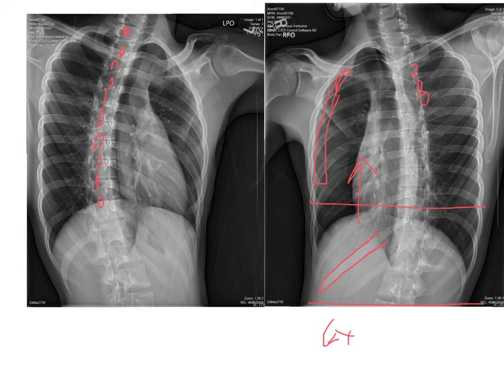Also remember that on below diaphragm projections, you will always do those AP. If you can do them supine, that's even better, because that flattens the abdominal tissues and organs so that you can penetrate more through those organs and tissue to get better detail of ribs 8 through 12. You will also do oblique below diaphragm ribs. Since you're starting with the AP position, you will only do an LPO or an RPO projection for the ribs. Just follow your oblique instructions there. Again, it's 45 degrees obliquity.